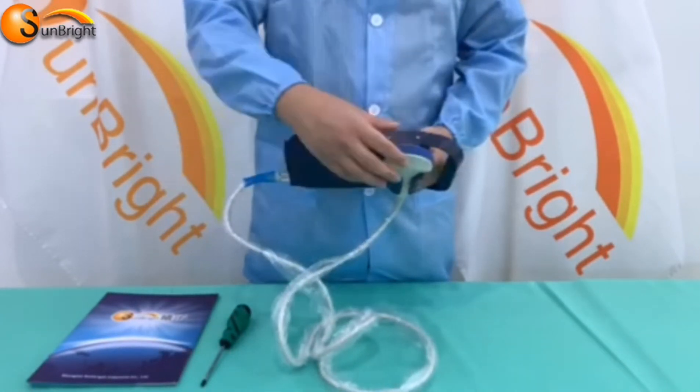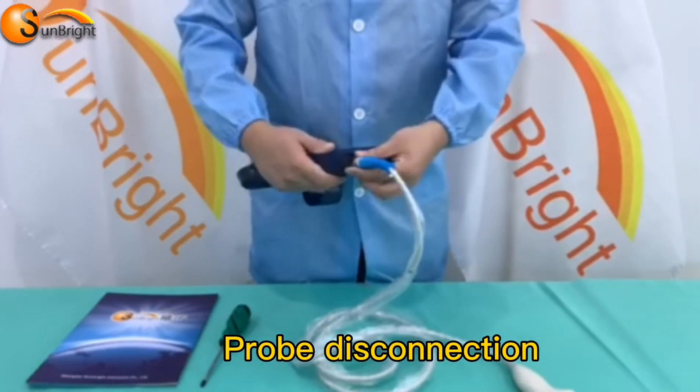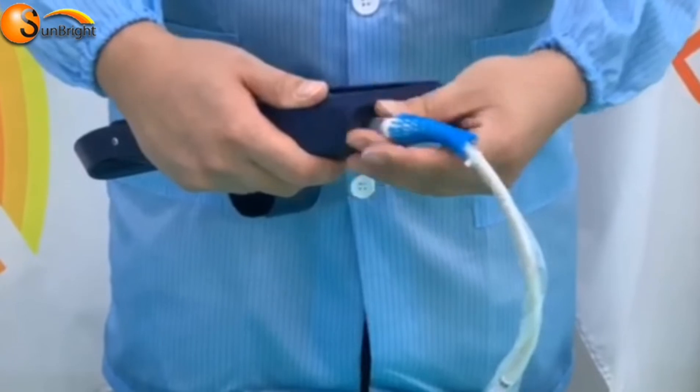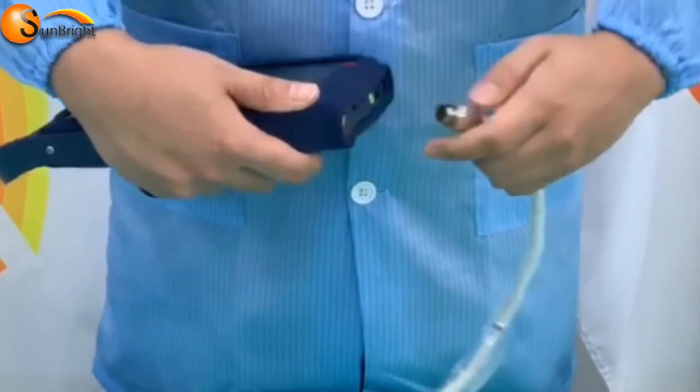Probe disconnection: rotate the safe sleeve anti-clockwise to the bottom position, then plug out the probe from the probe connector.